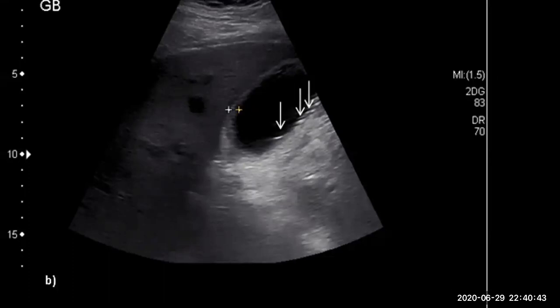But can a stone not cause shadowing? Yes, it can. Cholesterol, pigmented stone. Any stone causes shadowing, in spite of its type: cholesterol, pigmented, calcified, non-calcified, doesn't matter, okay? But it depends on the size of the stone and the ultrasound beam. If the stone is small, maybe less than 3 millimeters, I don't remember the number, it will not cause shadowing. So you should change the probe, for example from 3.5 megahertz to 5 megahertz, and repeat the scan, and you will see the shadowing of the stone, okay?